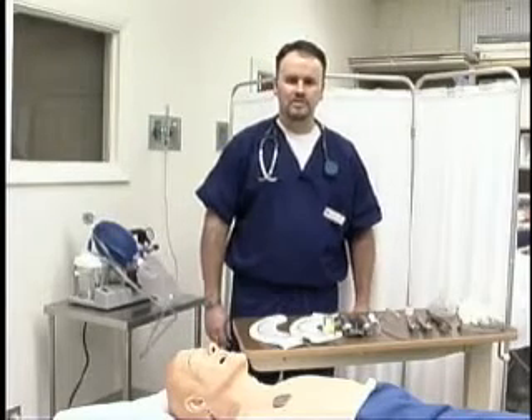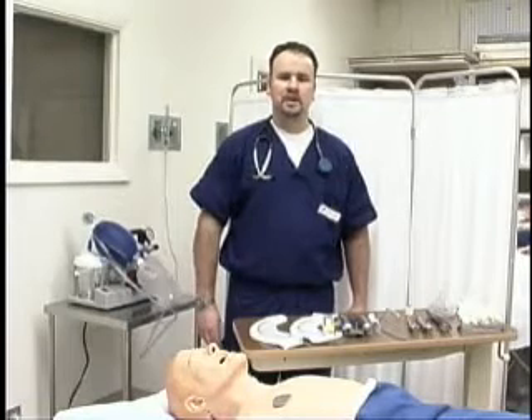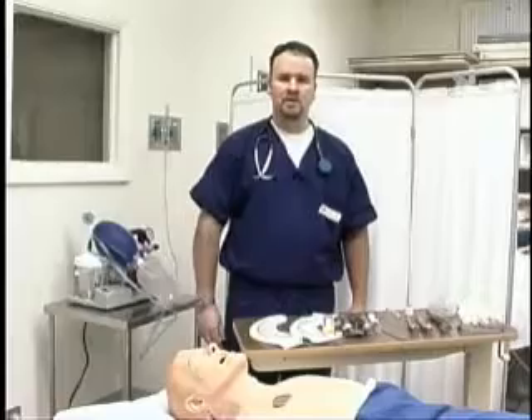I'm Patrick from Valencia Community College. I'm a clinical adjunct instructor for the respiratory program. Today we're going to do a demonstration of oral endotracheal intubation on a mannequin.